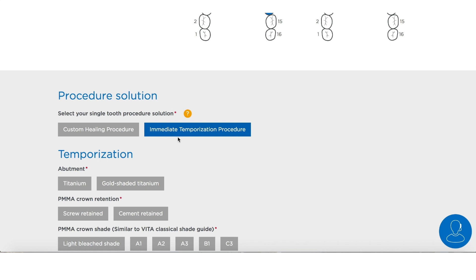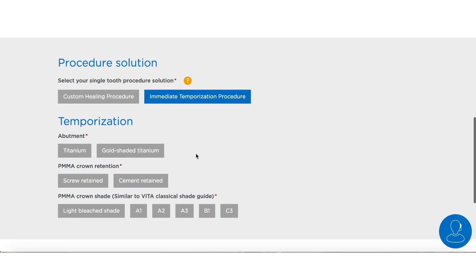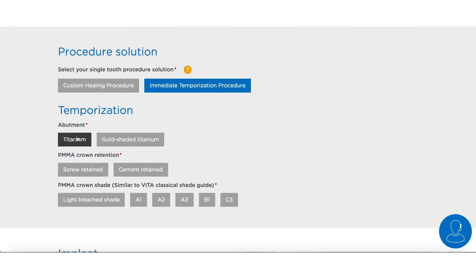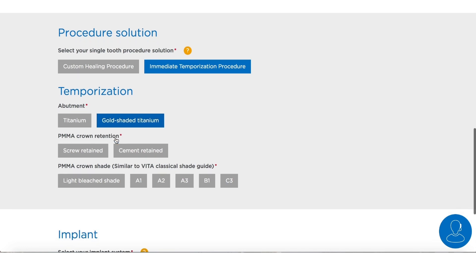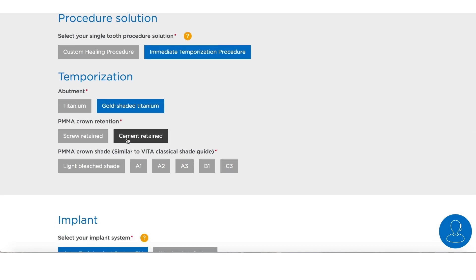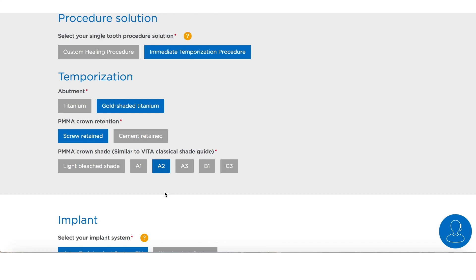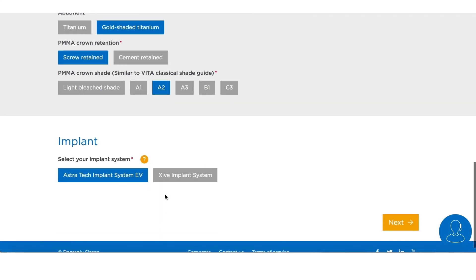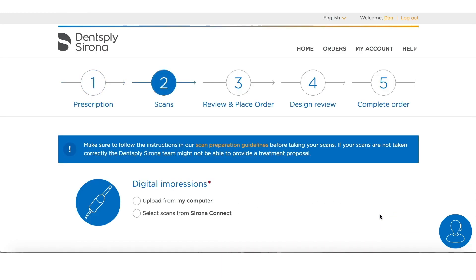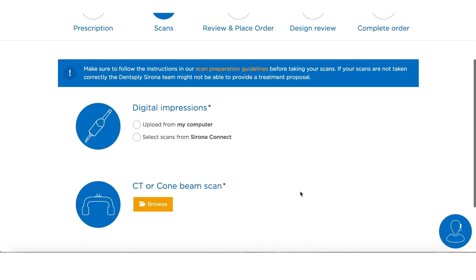Then we have a choice between two procedure solutions: if we want just a custom healing procedure we would select that, otherwise we would choose an immediate temporization procedure. We choose the color of our abutment — whether it's gold shaded titanium or titanium — we choose either a cement retained temporary or a screw retained temporary crown, and then finally we choose the shade for our temporary crown. Then we have a choice between either an Astra EV implant or the Zive system.